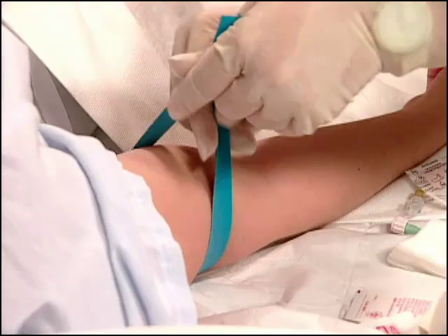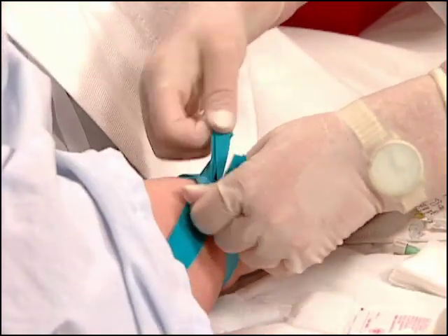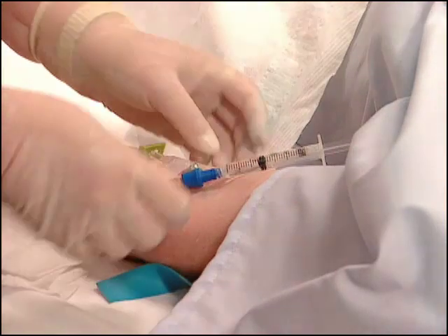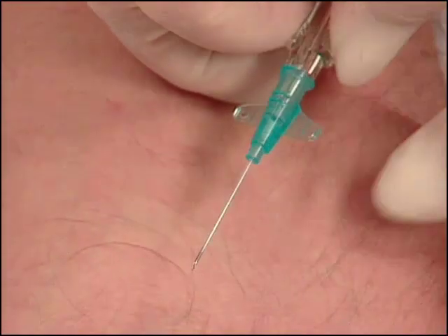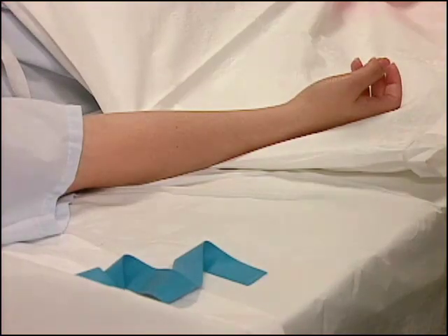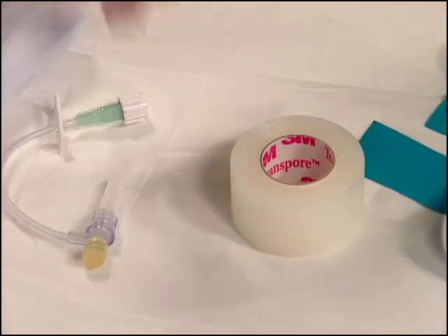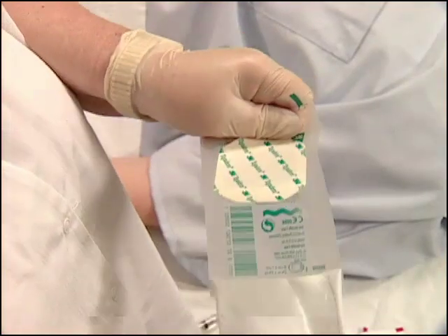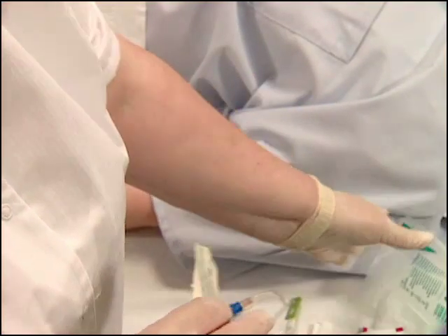In order to gain the confidence and cooperation of your patients, begin by making them as comfortable as possible, and then inform them about the procedure at hand. Address patients using language that would be understandable given their age and background. In some cases, this may require an interpreter.